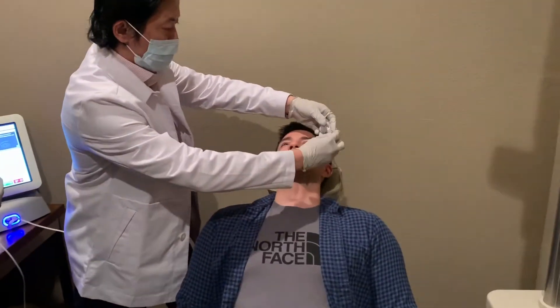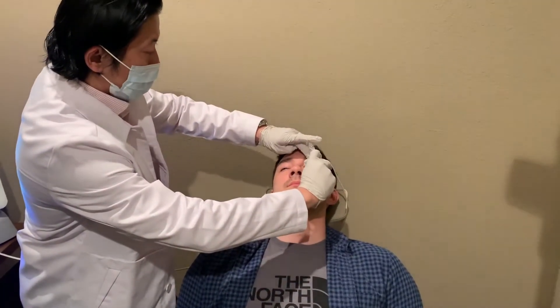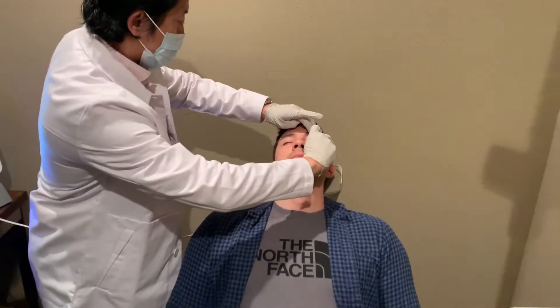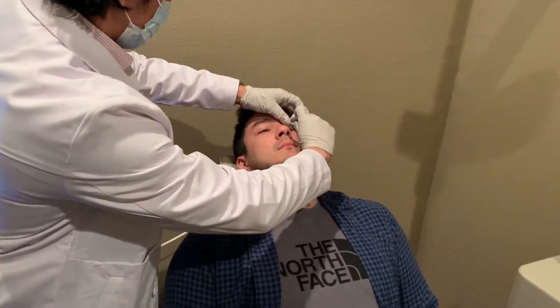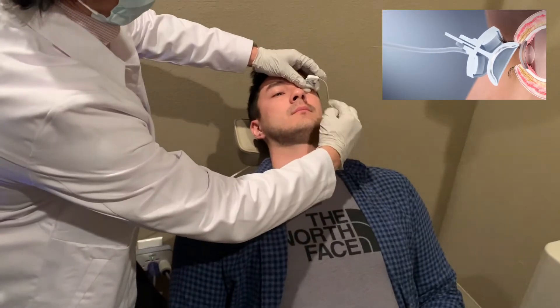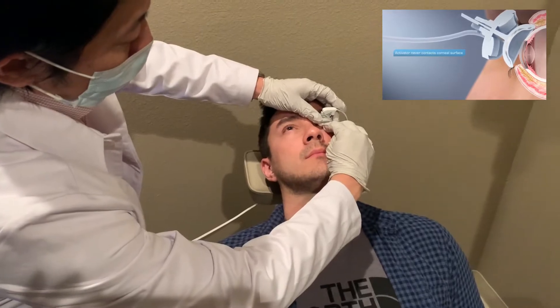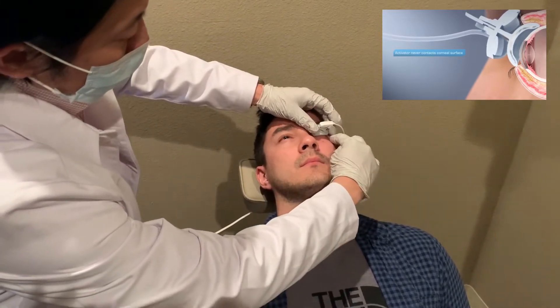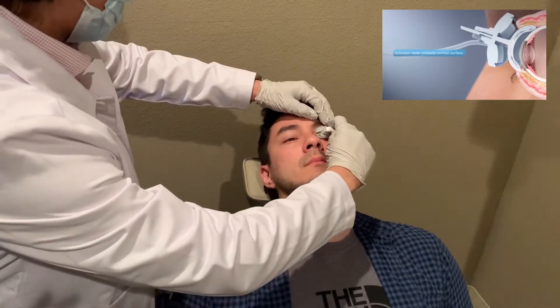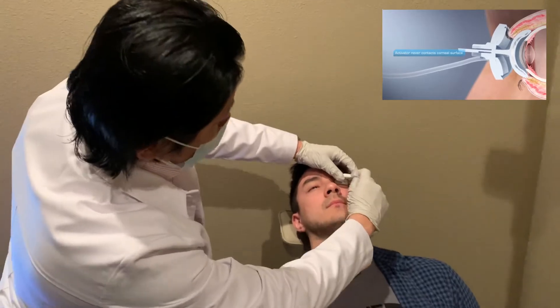I'm going to first have you look down. Now I'm going to have you look up and we're going to tuck your little eyelids. There you go. So it goes right around there, and it's going to tuck right in there. Now look straight ahead. This is where we make sure we get as much surface area.